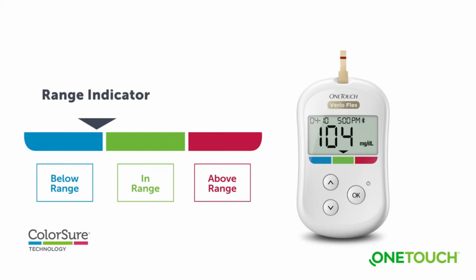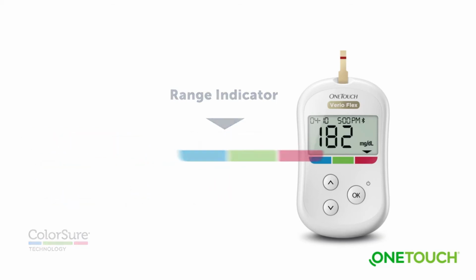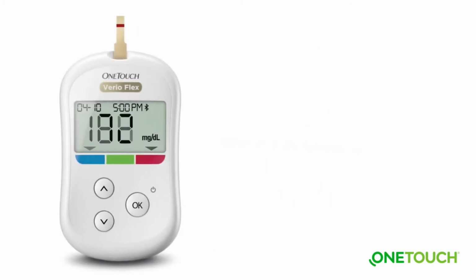your results. The low and high range limits set in the OneTouch Verio Flex Meter apply to all glucose test results. This includes tests taken before or after mealtimes, medications, and around any other activities that may affect blood glucose. Your meter uses low and high range limits to tell you when your result is below, above, or within your set range. The meter comes with preset range limits, which can be changed.